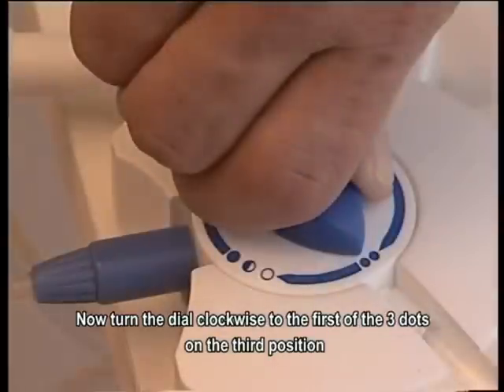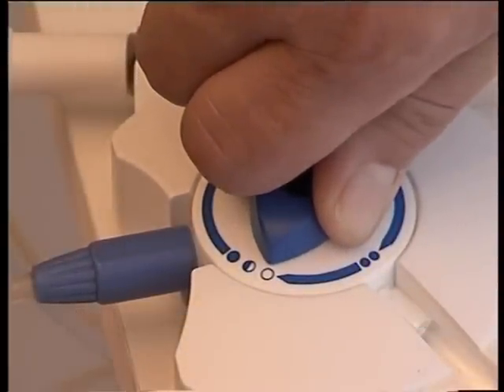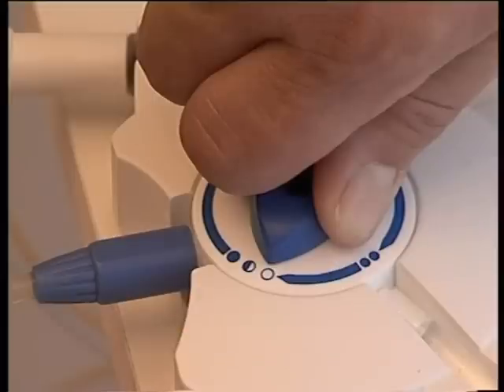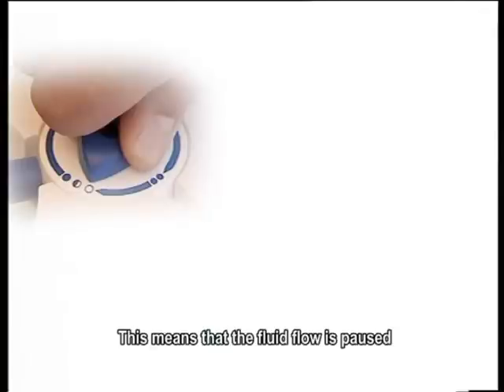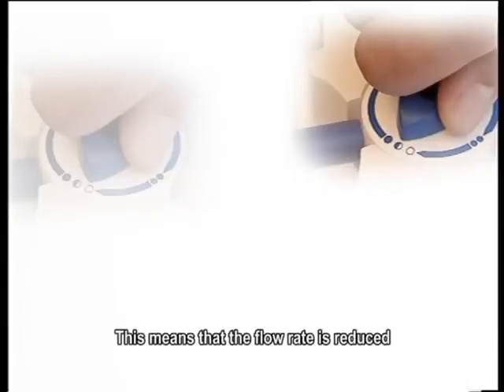Now turn the dial clockwise to the first of the three dots on the third position. These three dots offer flexible inflow rates. On the first dot, you will notice an open circle. This means that the fluid flow is paused. On the second dot, you will notice a half open circle. This means that the flow rate is reduced.